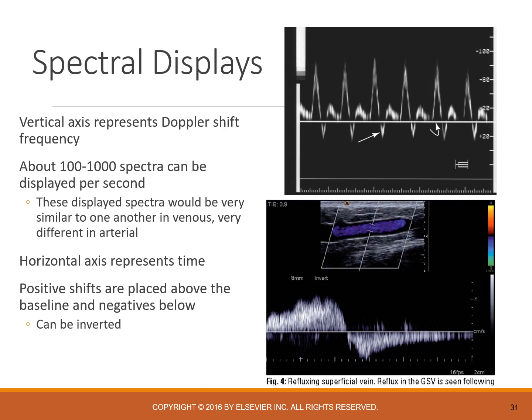Okay, so I pretty much covered all of this in that last slide, but one thing we haven't looked at much was venous, and then a couple little notes off this slide. We did look at that biphasic waveform in the last example. Now this one, you're going to see a fast systolic upstroke, so that means I have good pressure behind me. Early diastolic, I'm going to go all the way to a stop, and then I have pressure ahead of me pushing me back, and then the Windkessel effect pushes me forward. So I'm going to call this a triphasic waveform.